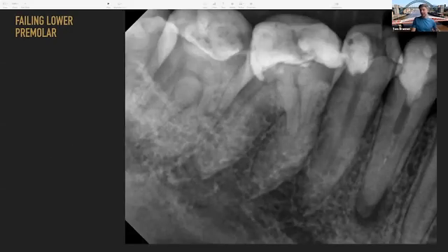All premolars today. But yeah, another lower 4. This one, it's a bit of a strange one because you can see there's a really wide canal space and then it suddenly disappears. So is this potentially where somebody's tried to access and search for canals and not been able to find them? Or has it just always been quite wide, and then is it a tooth that actually then splits off and goes into different areas?